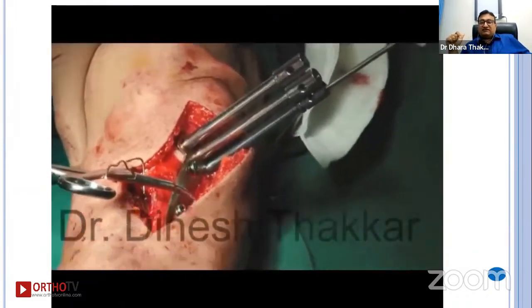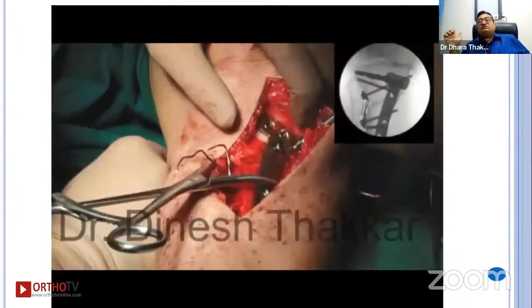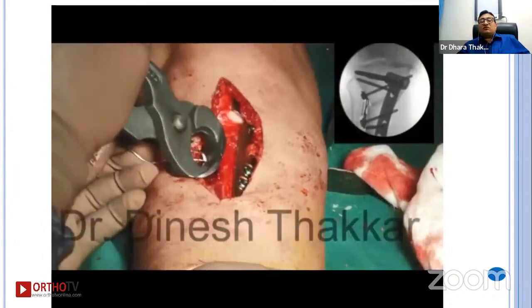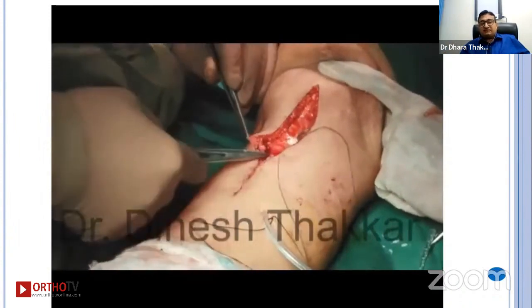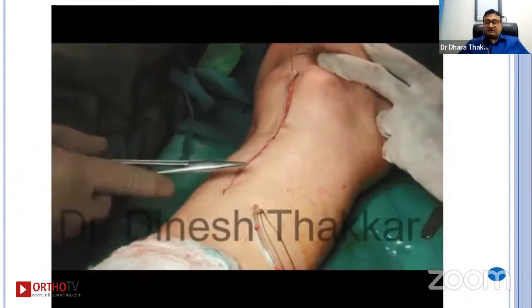Otherwise, sometimes I cannot get the space on the proximal fragment to pass a cortical screw. So I have to pass only three locking screws in the proximal fragment. This is how we fix it. Proximal, and then the distal screw is also being fixed. Remaining SS wire is also being cut, and this is after closure of the osteotomy. This is how we are doing closed wedge high tibial osteotomy.